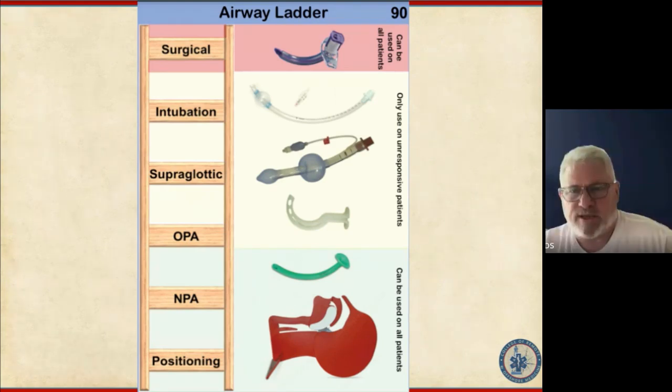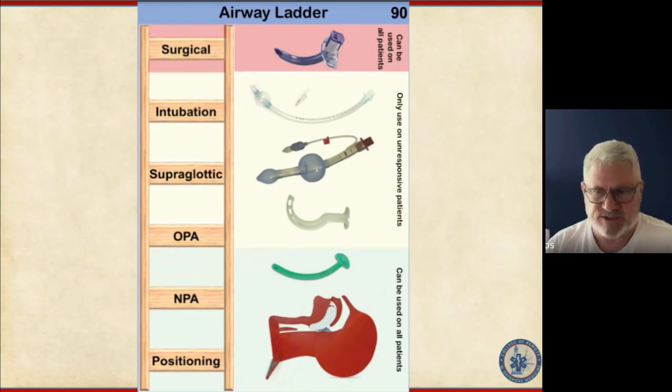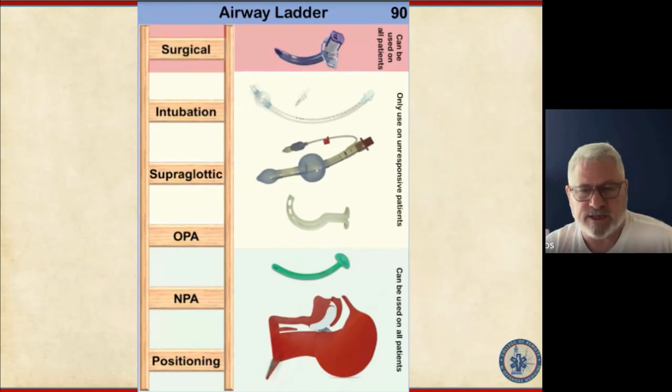I think the NPA gets a bad rap because of maybe lack of training or lack of emphasis on proper sizing, proper positioning, the need, the justification, and verification that it's effective. I think all of those things are reasons why NPA gets kind of a bad rap. The OPA, as stated later in the slide deck, says that it's not tolerated. I would modify that to say that it's rarely tolerated.